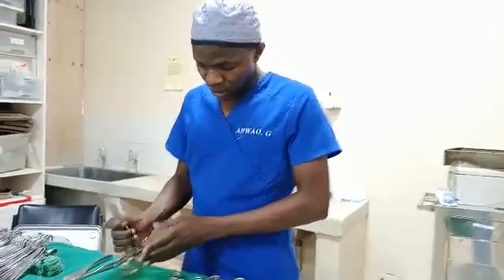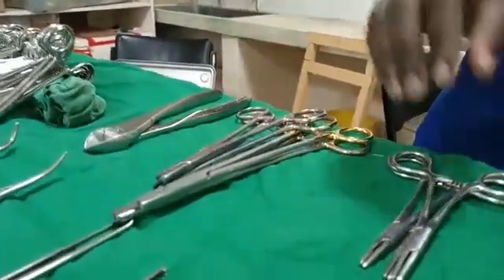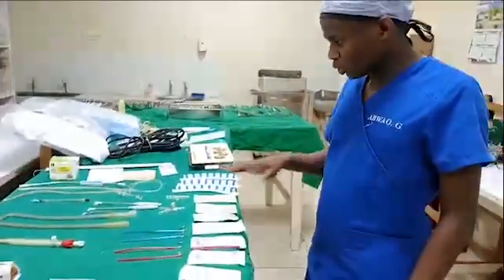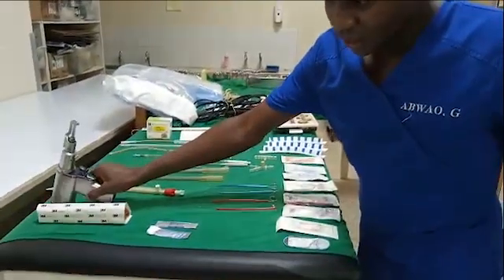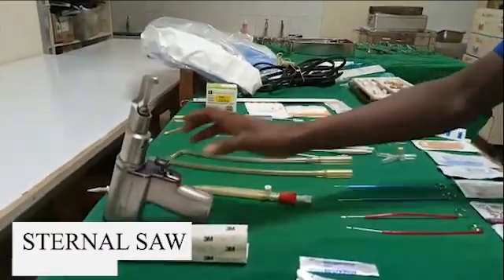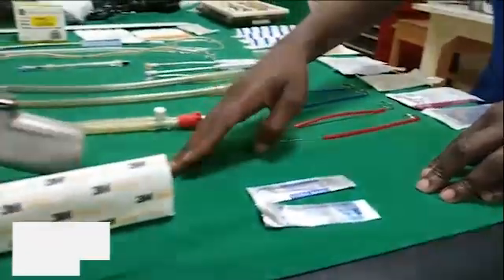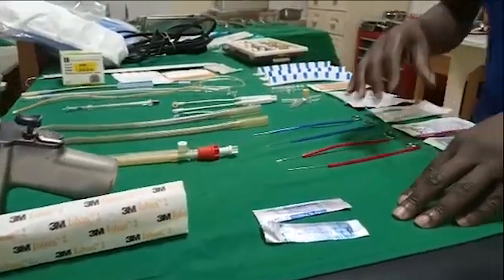These are the wires that we use — different sizes. After the wires, we will put different stitches for the fascia and skin. These are our consumables. Here is the sternal saw, and we have a battery for it. The blades — we have different sizes, number 15 and number 11. We have Ioband, which we apply to give a sterile field view of where we operate.